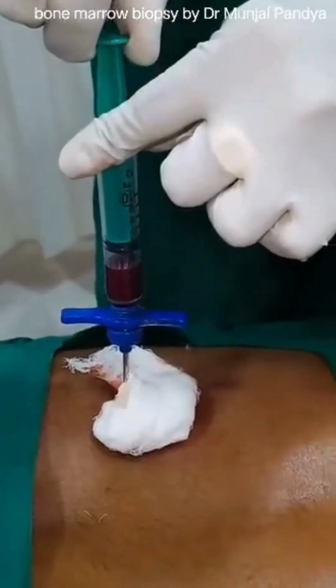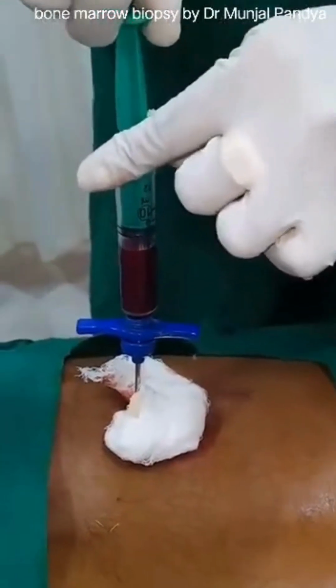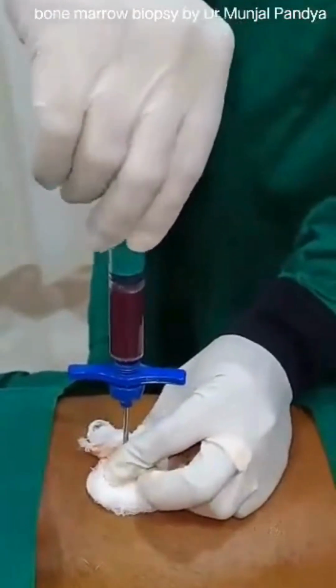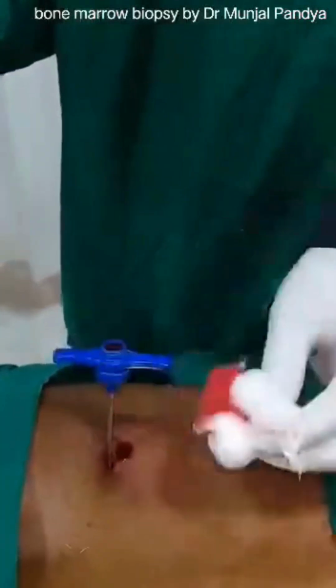Relax. It's done, brother, it's done. So sometimes this is a real sign. When you suck the bone marrow, they feel the sucking sensation of pain. So that means you are in the cavity, in the marrow cavity. So he is feeling the same thing.